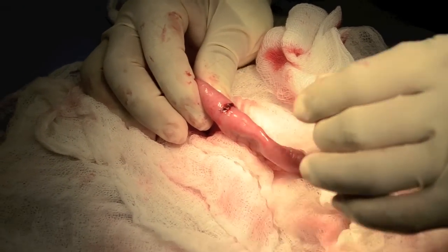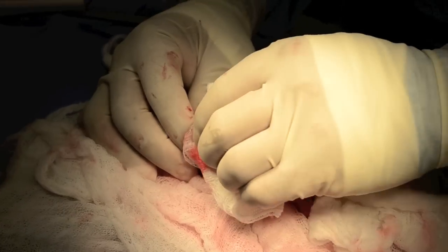Closure is complete. I do not routinely pressure test the closure from a GI biopsy.